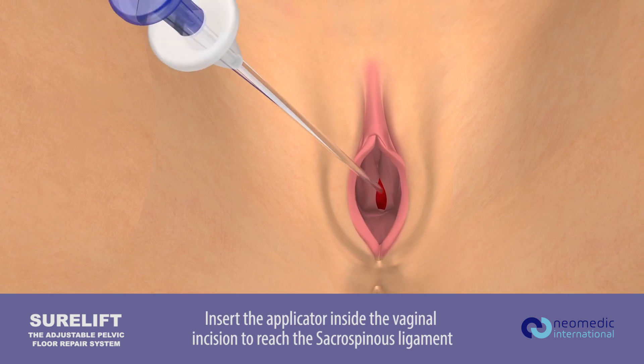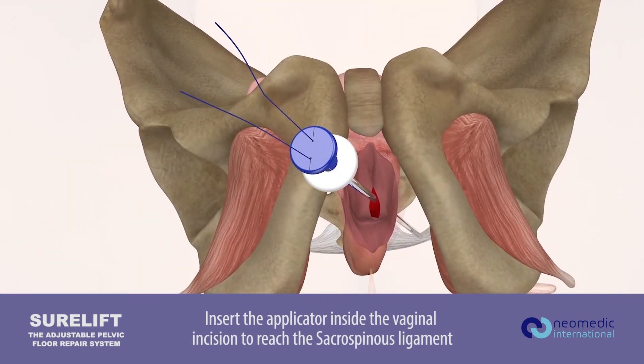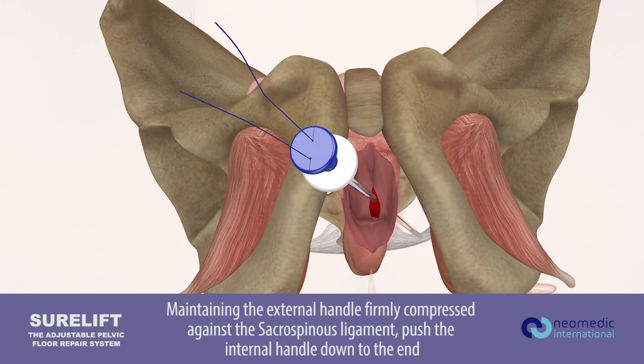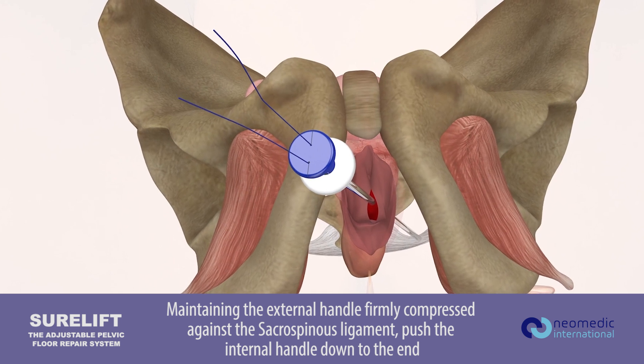Insert the applicator inside the vaginal incision to reach the sacrospinous ligament. Place the system tip compressing the external shaft against the sacrospinous ligament. Maintaining the external handle firmly compressed against the sacrospinous ligament, push the internal handle down to the end.